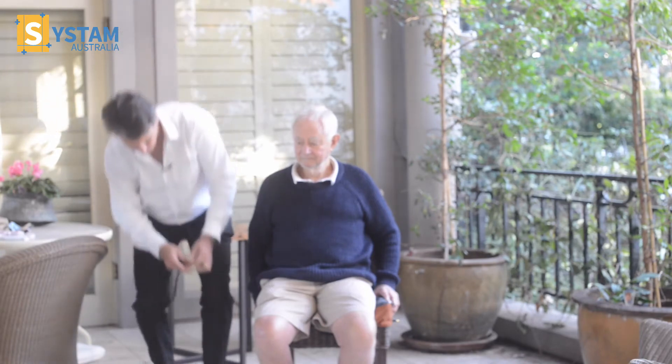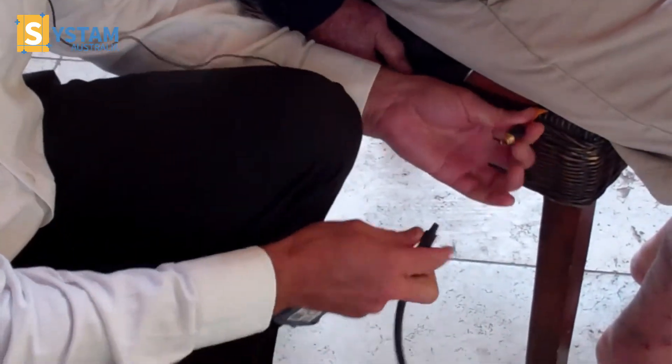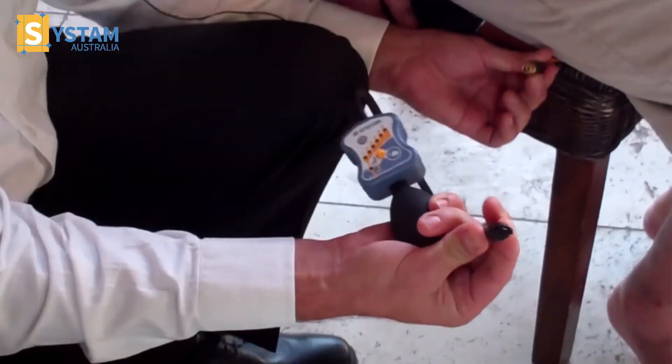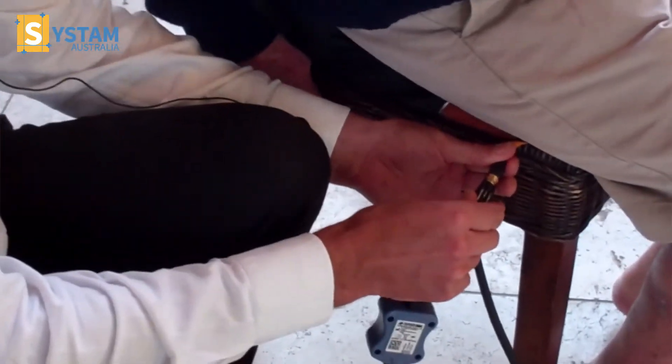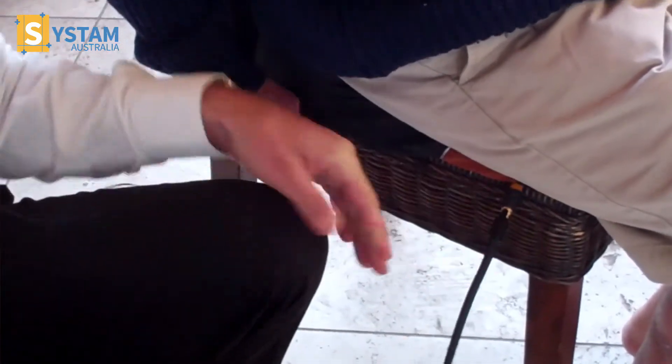So I've got the pump here. We'll find the valve on the right hand side and pull it out. We grab the end of the hose and we locate it over the top of the valve and we just push it in. It's nice and secure.